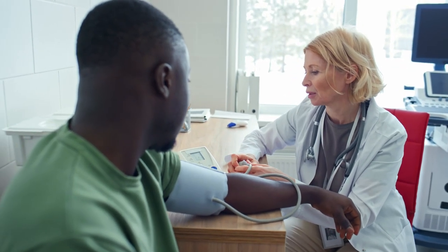Once a year, you should take the device to your doctor's office to have it calibrated and have them show you how to use it correctly, comparing your technique to make sure you're doing it right.